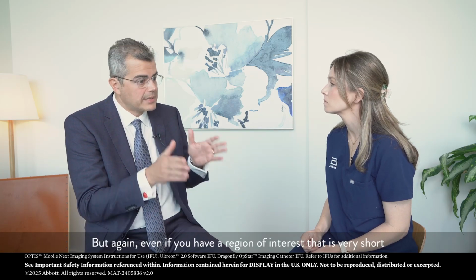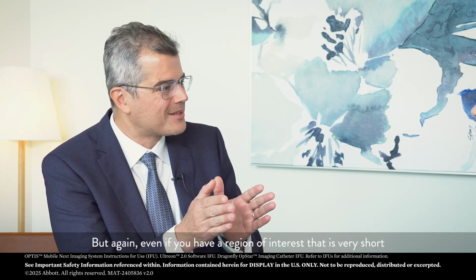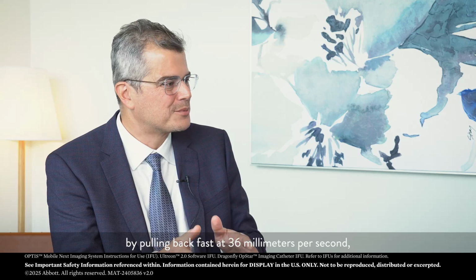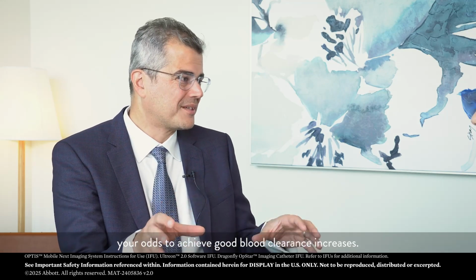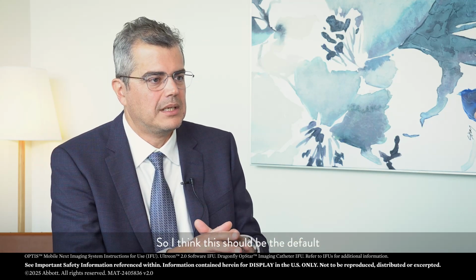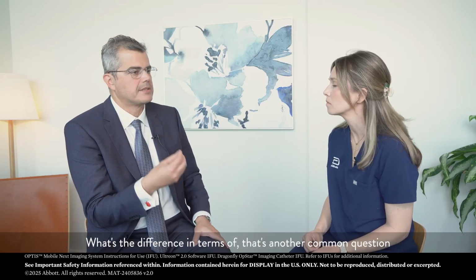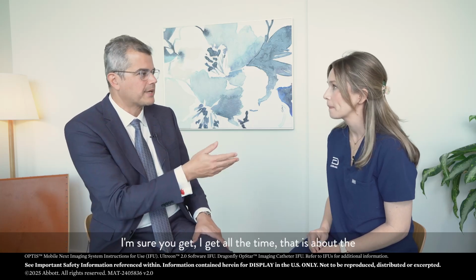But again, even if you have a region of interest that is very short, by pulling back fast, at 36 millimeters per second, your odds to achieve good blood clearance increase. So I think this should be the default for virtually every pullback. What's the difference in terms of, that's another common question I'm sure you get, I get.